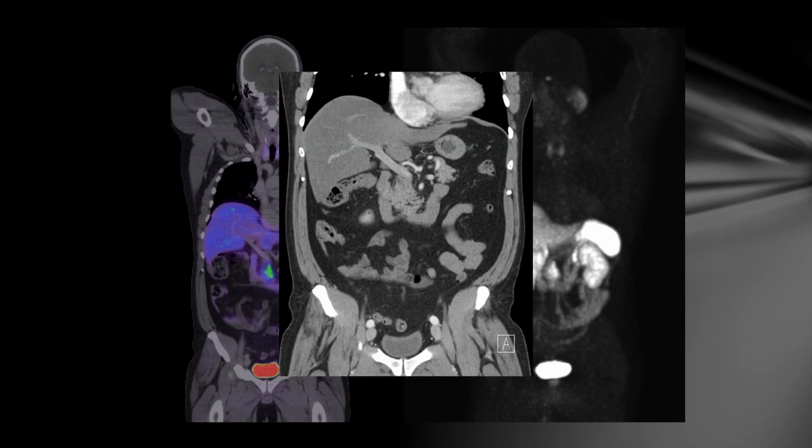There are also other lesions, for example, lesions within the bone that can take up the tracer and can show as hot on the PET-CT. There are inflammatory conditions such as prostatitis, sarcoidosis, or post-treatment changes. And importantly, there are other tumours such as meningiomas, which is a benign tumour within the brain, and lymphoma, which can take up some of the tracer and produce a hot spot.